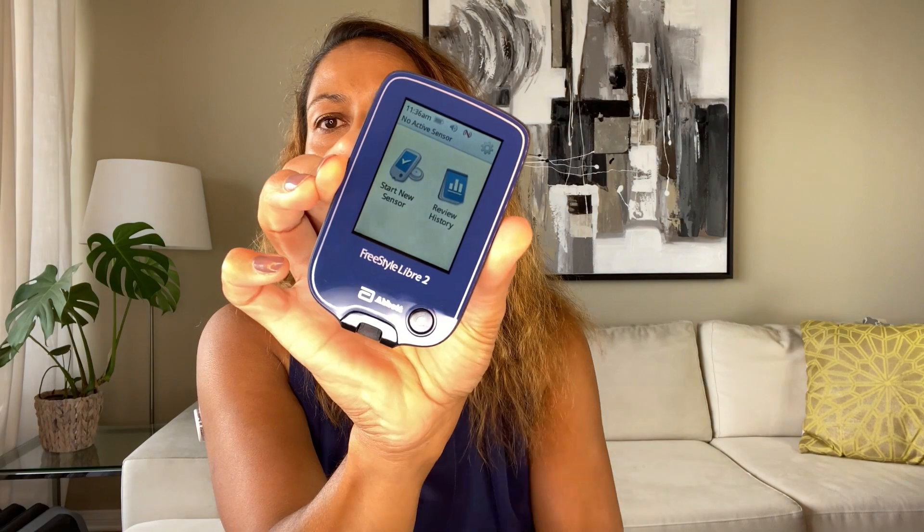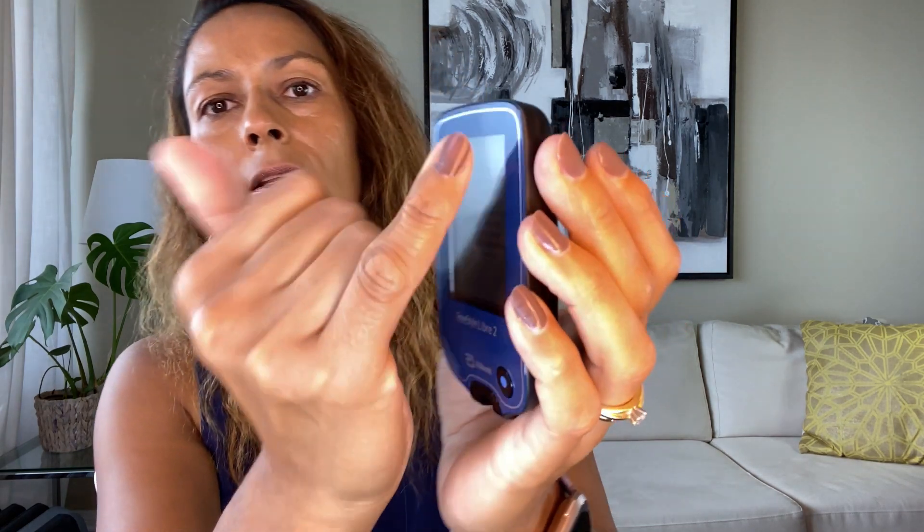Next, we want to start it in the reader. Take out the reader and press the big button. It turns on and prompts you — it says 'Do you want to start new sensor?' Click that. Then it tells you to hold the reader up towards the sensor to scan it. It gives a warning that high doses of vitamin C can affect readings. Click OK. New sensor is starting up — sensor can be used in 60 minutes. The startup period for the Libre 2 is 60 minutes, so in 60 minutes I should start getting readings.